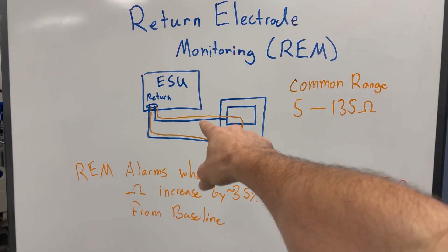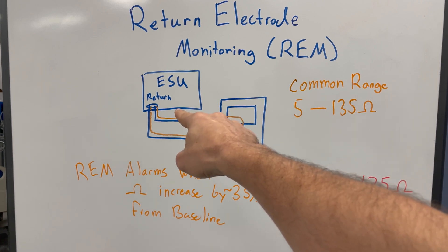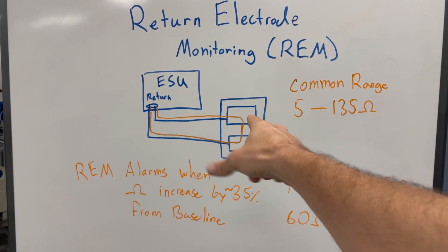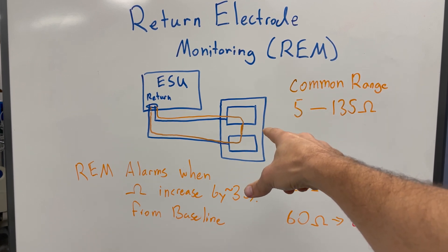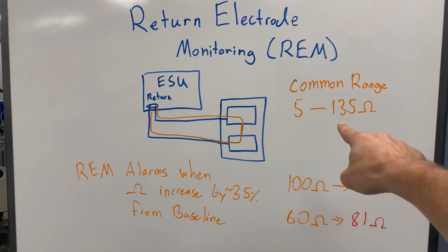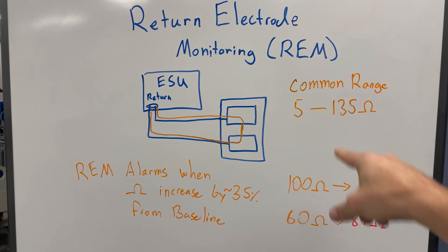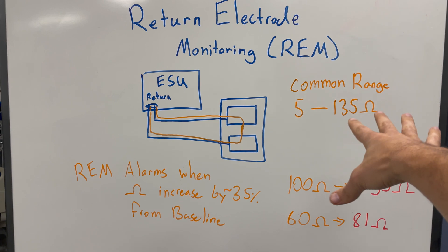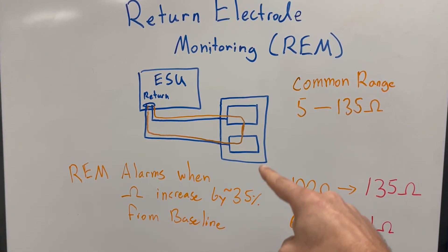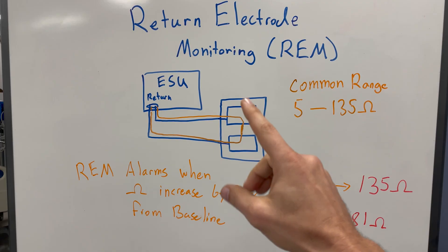We have the ESU, the return plugged in, and the split pad electrode. It's basically acting as a multimeter: those two pads act as the probes, measuring the resistance between the two paths. Common resistance measurements are going to be 5 to 135 ohms — that's the range the ESU will measure. If that resistance increases by 35% from baseline — I did note a slight discrepancy in the service manual suggesting 40% — the REM circuit is going to alarm.